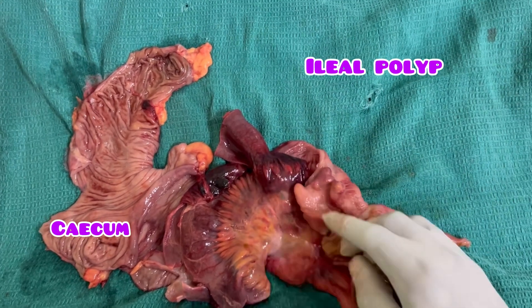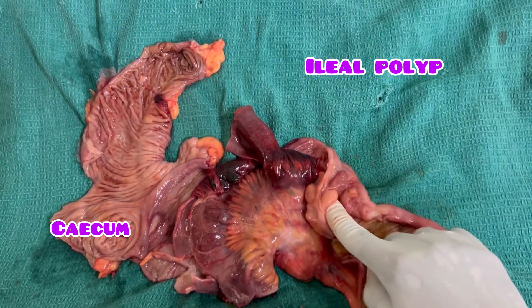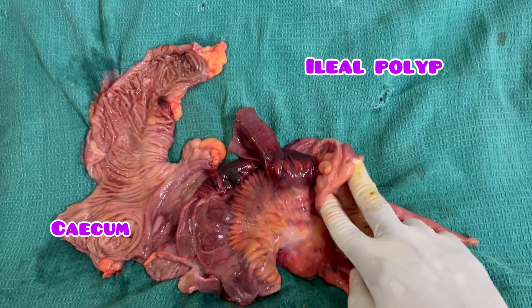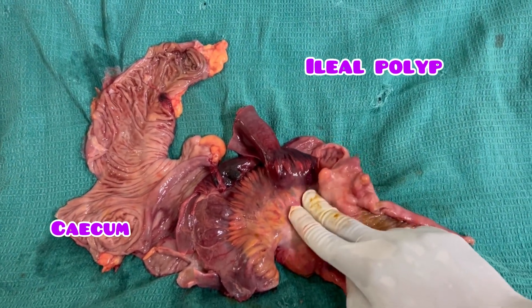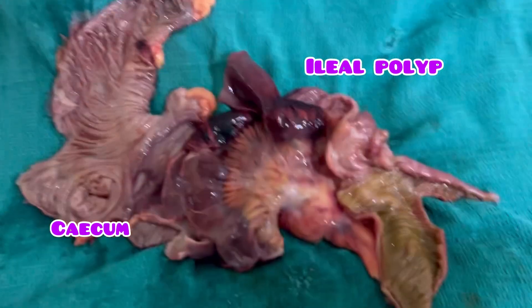Such a huge intussusception caused only by a small polyp — this is the polyp which caused the entire ileo-ileocolic intussusception. Such a small polyp causing such a massive ileo-ileocolic intussusception.